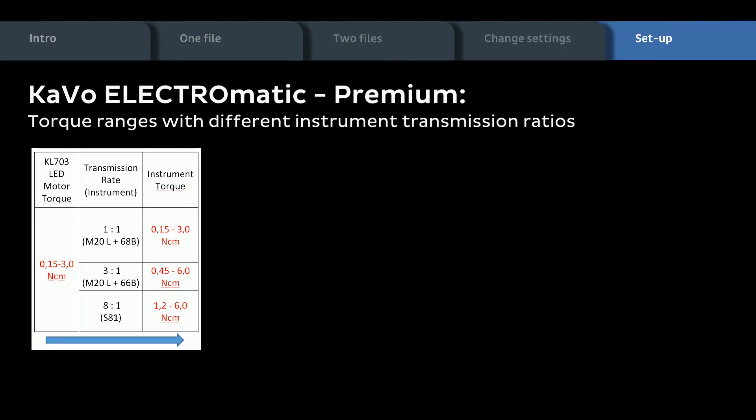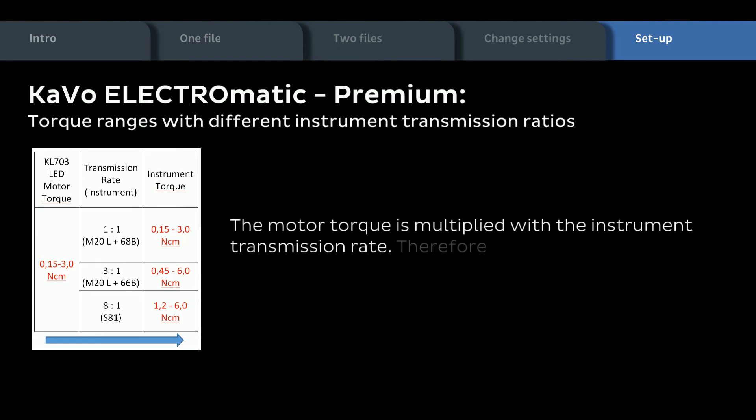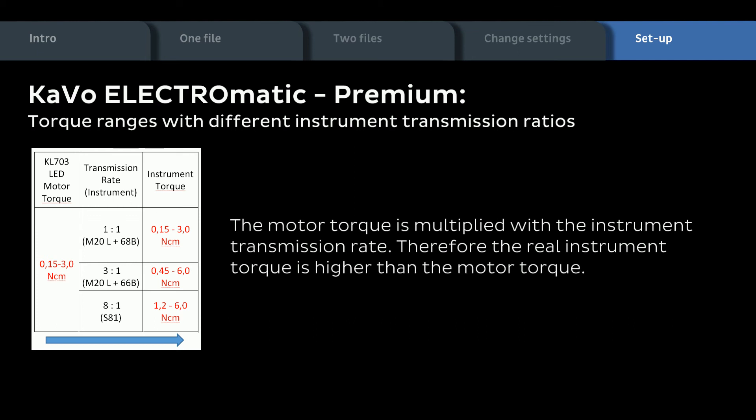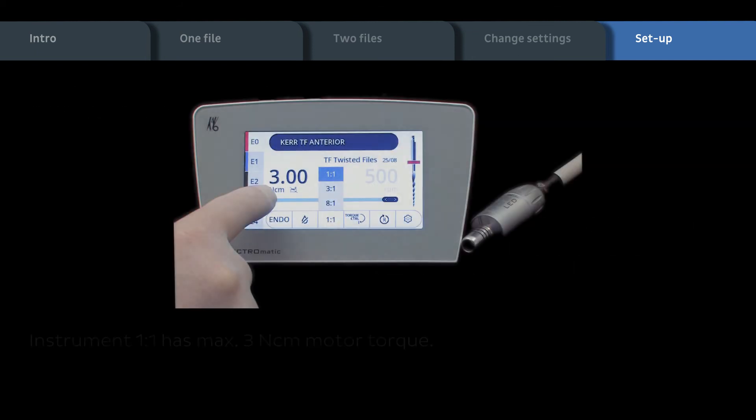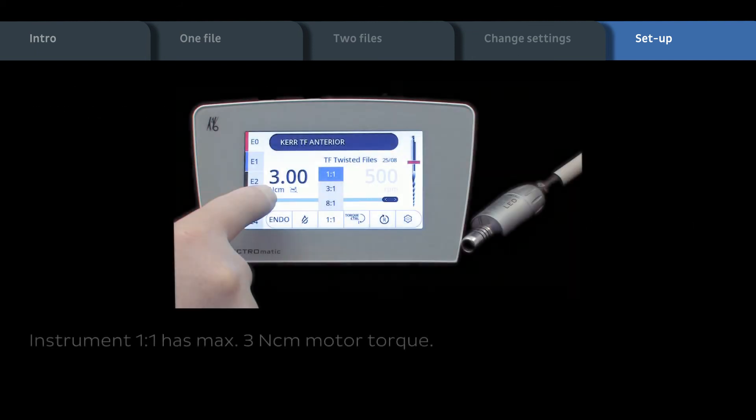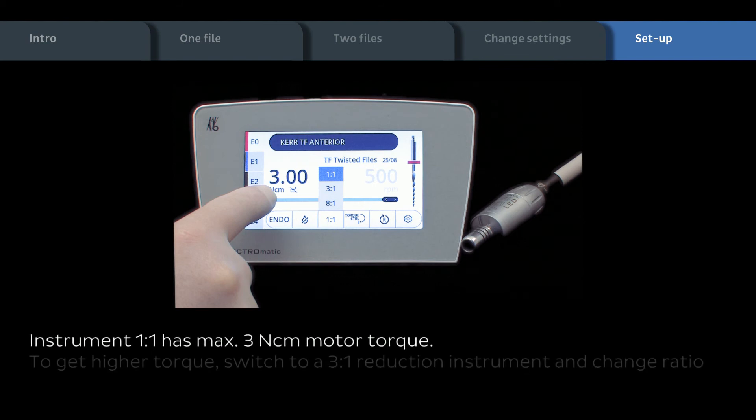Torque ranges with different instrument transmission ratios. The motor torque is multiplied with the instrument transmission rate. Therefore, the real instrument torque is higher than the motor torque. Instrument 1 to 1 has a maximum of 3 Nm motor torque.